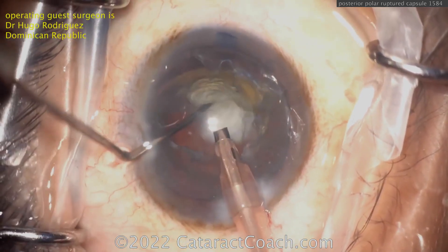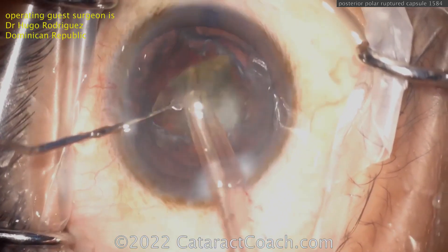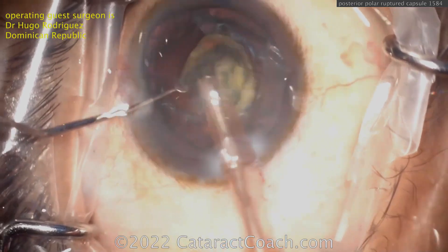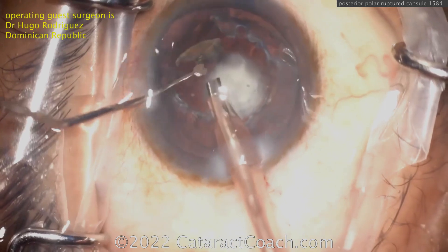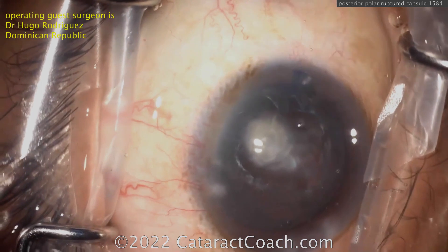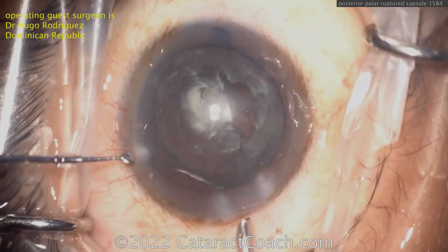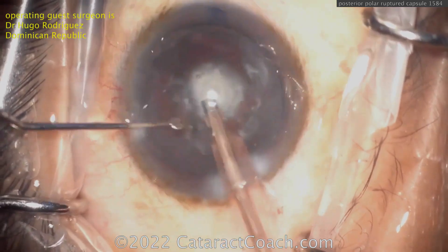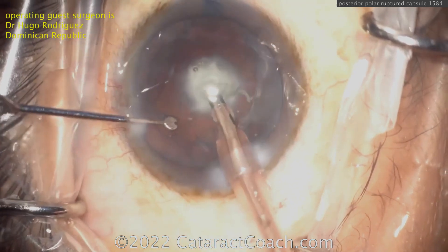Now removing that endonucleus — here's the last bit of it, comes up pretty easy. Look in the bag: you still have the epinuclear shell and cortex all remaining, and that's looking good. Patients always want the best, and sometimes they're not accepting of reality, which is that it's the combination of the surgeon's technique plus the patient's tissues and healing combined that determine the outcome. Now it's time to remove that epinuclear shell and clean up some of the cortex — and this is where you're going to see the capsule open.